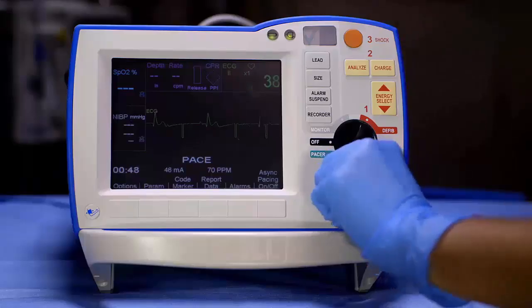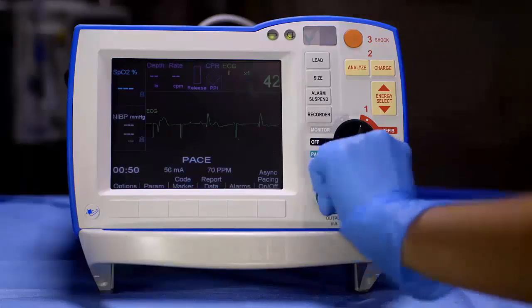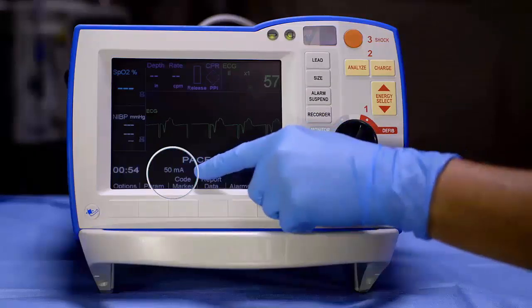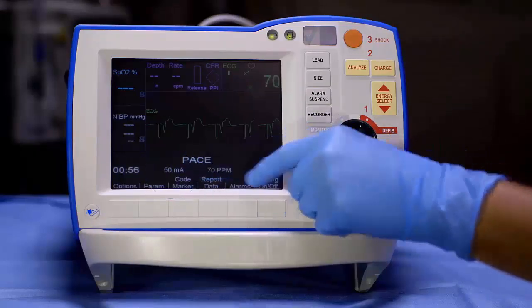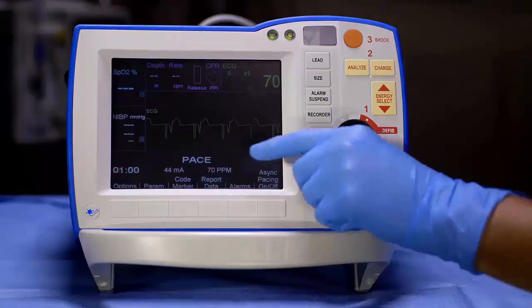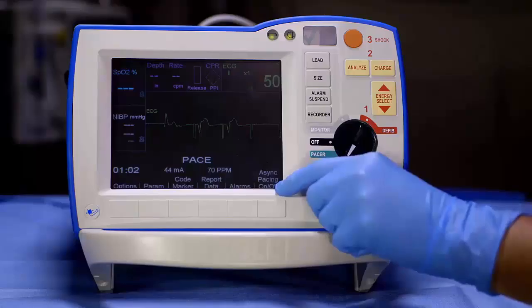Normal range for capture is between 40 and 80 milliamps. Usually, when obtaining capture, you will overshoot the patient's threshold. If this happens, decrease the output slowly until you just lose capture. The minimum output that obtains capture is the patient's threshold.